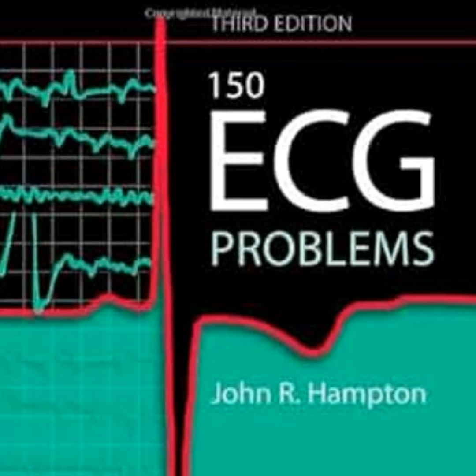You captured the mechanical timeline perfectly there. I mean, the ST segment elevation that we always look for only occurs after the transmembrane potential alters enough to create an actual current of injury. Oh, I see. Yeah, so in those early hours, the tissue is definitely ischemic, but the electrical gradient hasn't shifted yet. Which is terrifying, honestly. It is, and this is exactly why a normal ECG, in the face of really strong clinical suspicion, means absolutely nothing. So you admit them. Always. You have to admit the patient, observe them, perform serial ECGs, and crucially, track their plasma troponin levels.